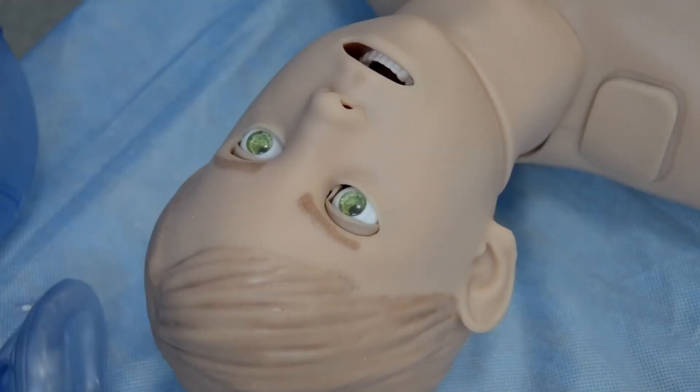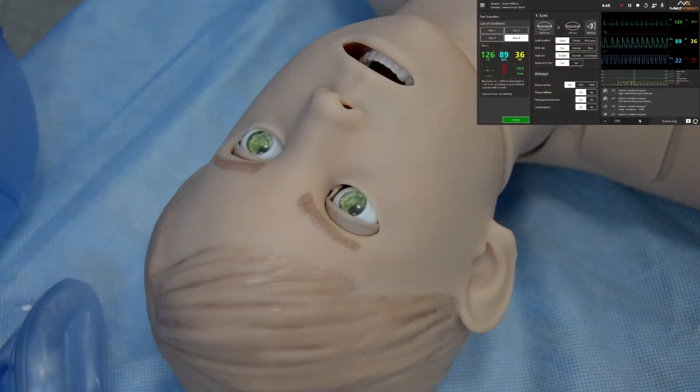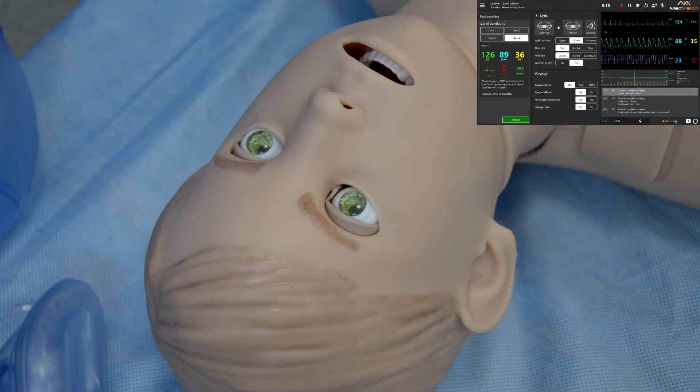Let's begin with the eyes. The eyes are fully programmable and respond to light. You can also change the size of the pupils in the software, so the pupils can be dilated and constricted. You can also change the blinking rate — fast, normal, or slow. The reaction can be unilateral or bilateral, and you can also change eyelid position, so the eyes can be half open or fully closed.